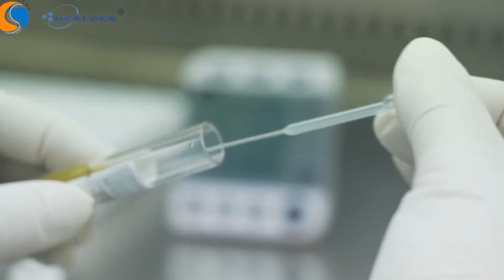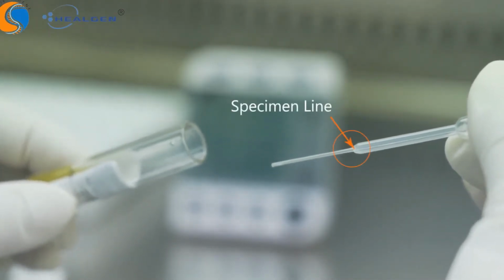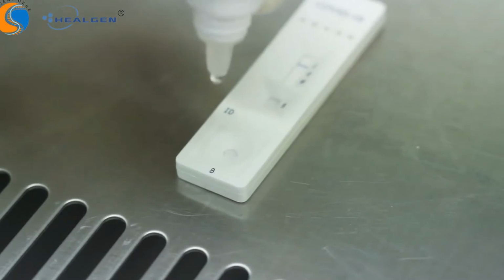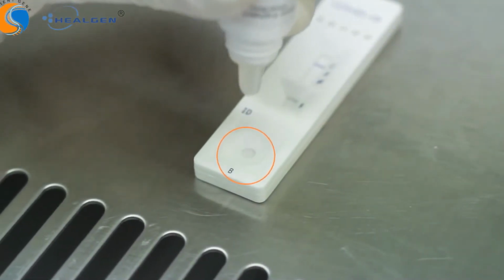When using a disposable dropper for serum or plasma specimen, draw specimen until it reaches the specimen line. Hold the dropper vertically and transfer 1 drop of drawn specimen into the sample well labeled as S on the test cassette. Then add 2 drops of buffer to the buffer well, labeled as B, immediately after.